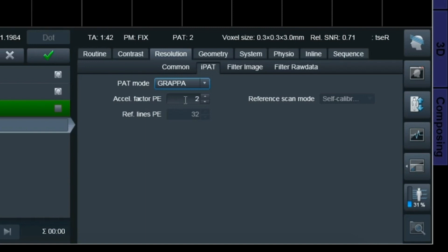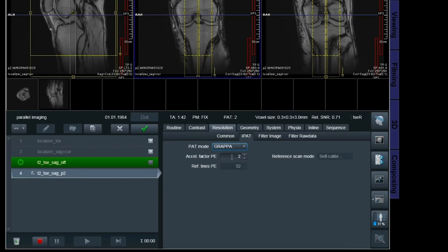With PAT2 on, look at the relative SNR — it now reads 0.71. But look at the scan time: it's now 1 minute and 42 seconds. So I saved a lot of scan time, but the pitfall is losing signal. Let's scan that one.